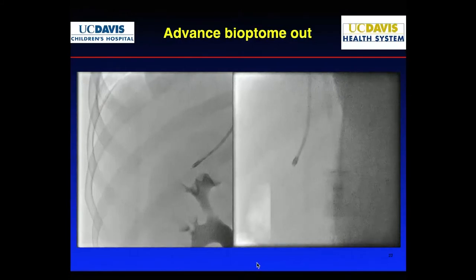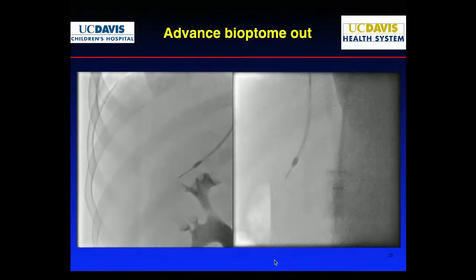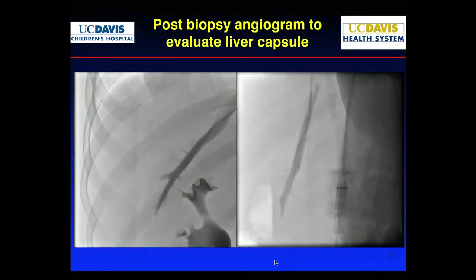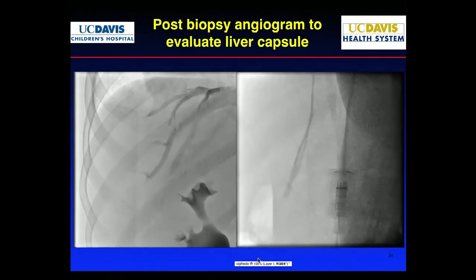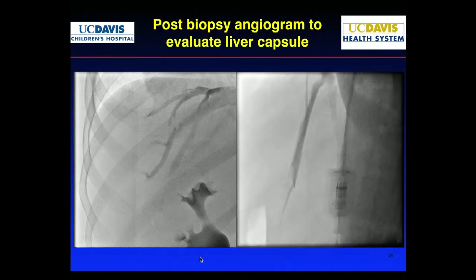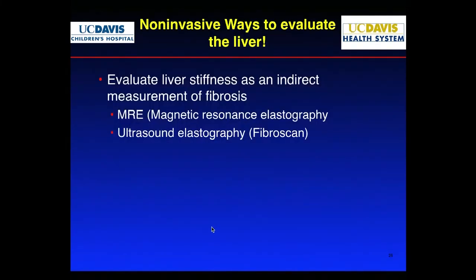And then we advance the biopsy out, and then we'll stab, and one hand is holding. I didn't show it, let me go back a little bit. I don't know if I can go back on this. Anyways, you saw the earlier part. So we take a picture. In this case, actually, we did not get the staining that I usually typically will see, but we got the specimens we needed. Now there are definitely lesser invasive ways to evaluate liver now.